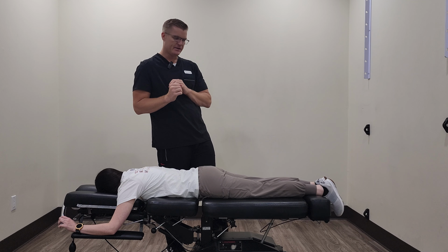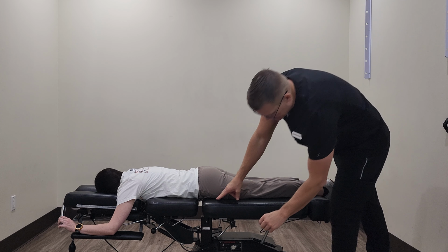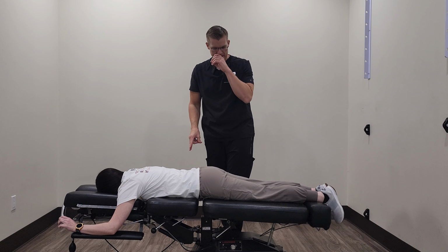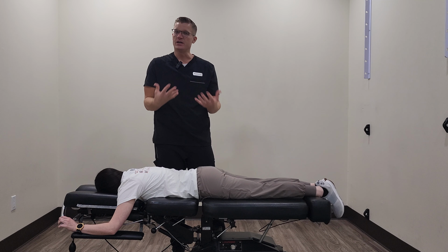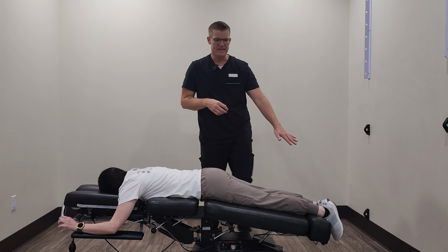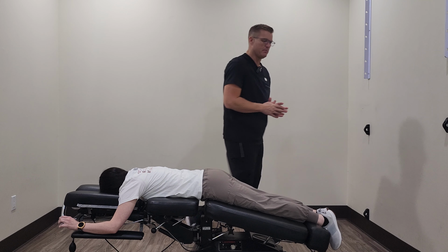So there's this little button down here that I'm going to push. And what we're going to do is turn on a little timer here, like that. And then I have a little pedal here that I'm going to turn on. Now the patient is going to slowly move up and down. Chelsea's younger and she's pretty darn healthy. She just has this little back issue. So as this table moves up and down, it's stretching and pulling this part of the spine apart.